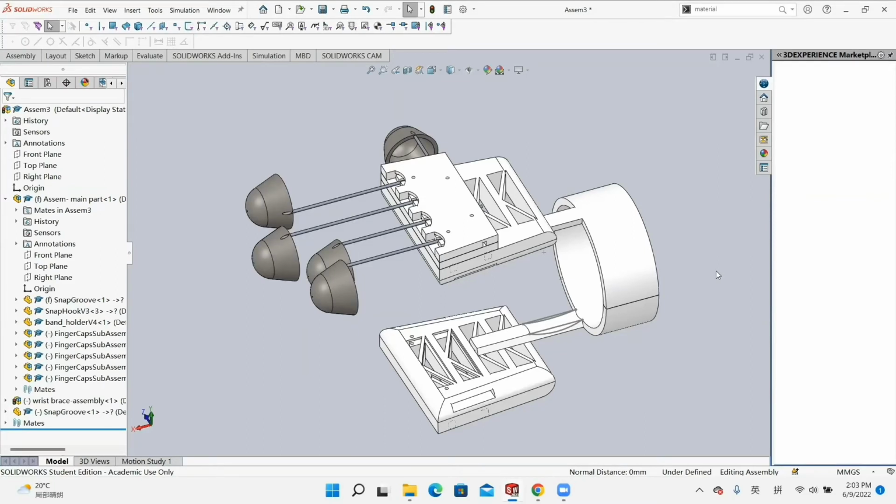Hi, I'm going to introduce the assembly of our project. The project has three parts on it. The first one is the functionality part with the band holder, snap groove parts, and snap hook parts. Also, the elastic cord with the finger cap for all 5 fingers in one hand.